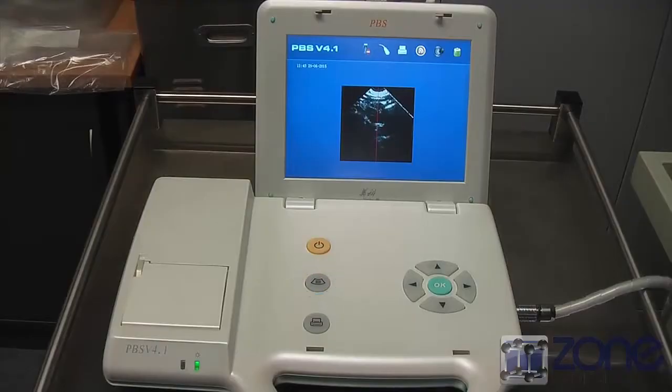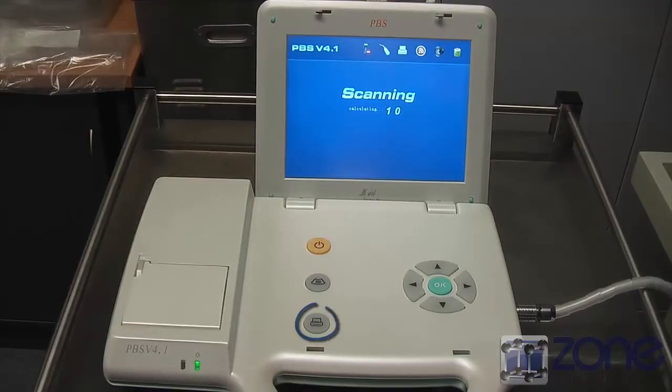You can also start a test by pressing the scan button. From here the device automatically measures the bladder volume through the probe. The results automatically appear when the test is done and you can now print the results by pressing the print button.